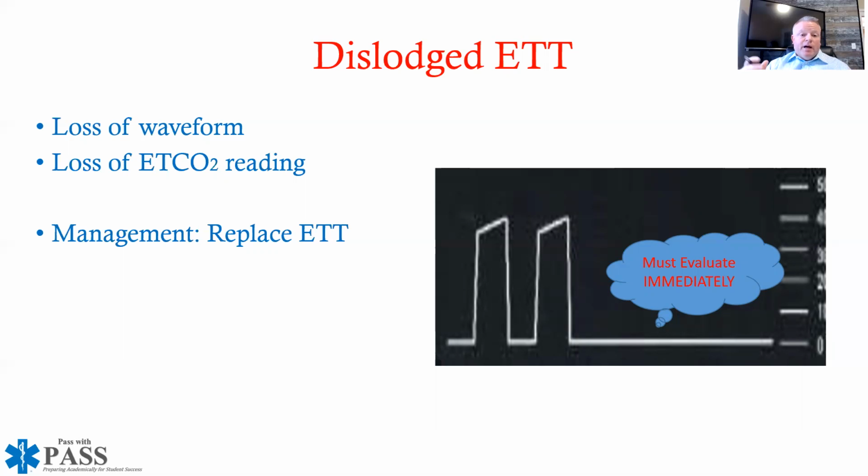And this is anybody, I know there's probably EMTs in the room, and this is for EMTs. It doesn't take a paramedic or anybody else to read this waveform. If you see that it all of a sudden becomes flat, make sure that you're monitoring that and trying to fix whatever your issue is.